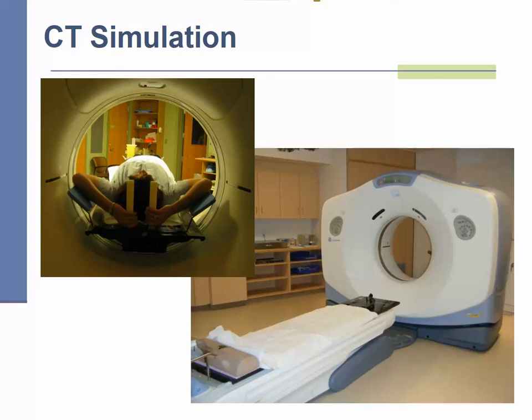So the CT simulation is necessary in order to plan the patient for daily treatment, and it helps us determine the dose delivered to various areas of the body as part of the planning process.